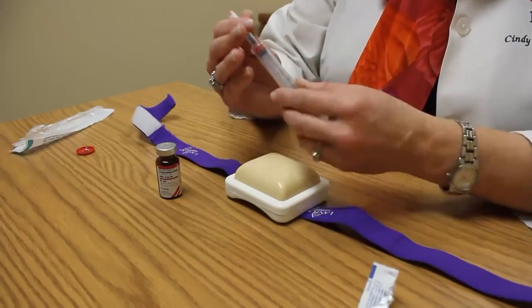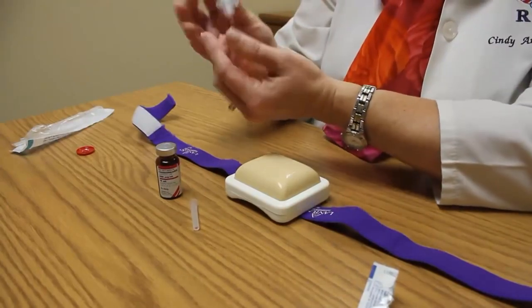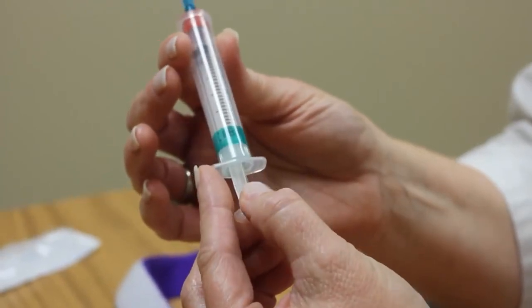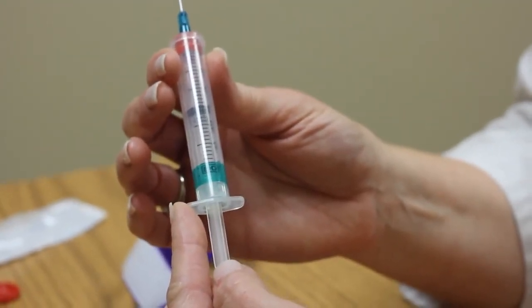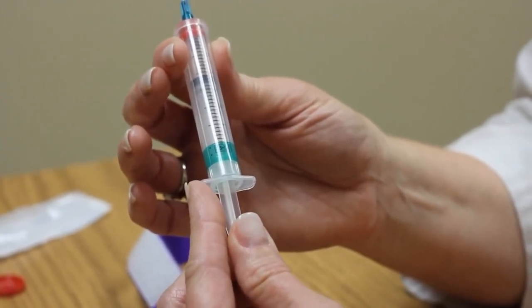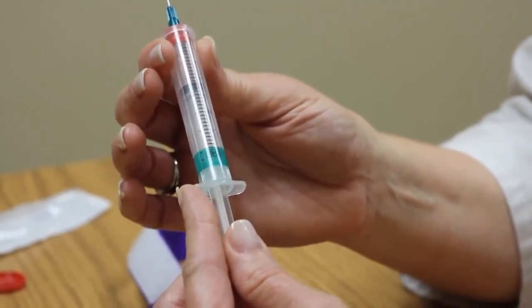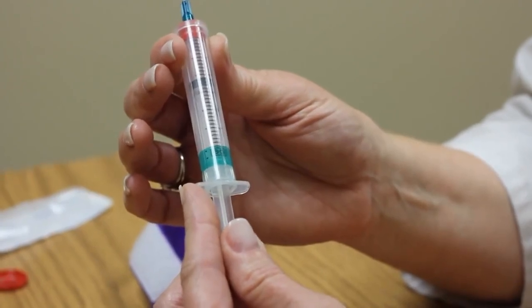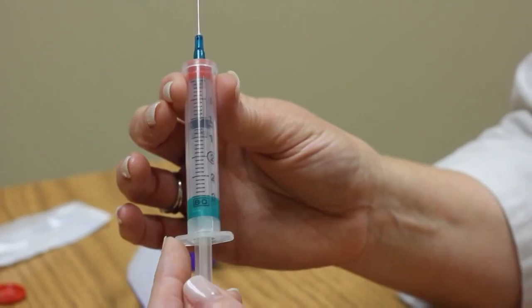Go ahead and pull the cap straight off of your needle. Then pull what we call the plunger — that's the little thing sticking out here. Hold on to the barrel of the syringe and simply pull the plunger down to the number 1. There's a little black rubber stopper in the syringe, and you will pull that black stopper all the way down until you reach the top of the line in the stopper. Basically you're going to draw in one cc of air into the syringe.